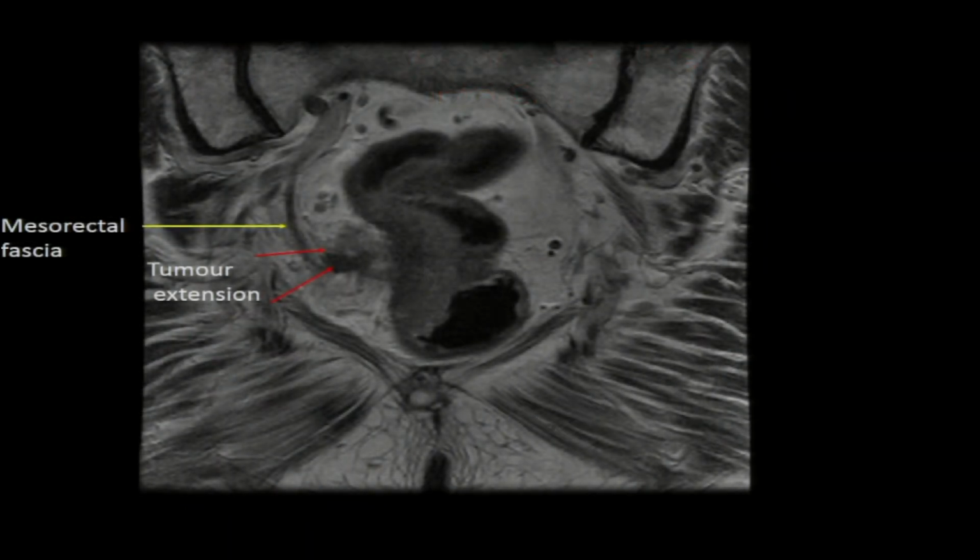This one is a little bit more subtle, and as you begin to see the circumferential resection margin here, you can see that the tumor is encroaching it, but perhaps is not breaching it.